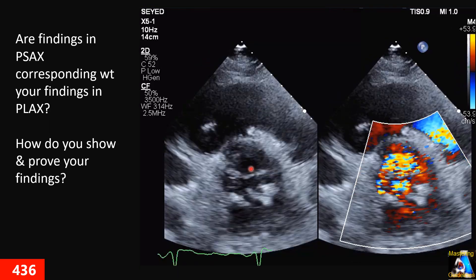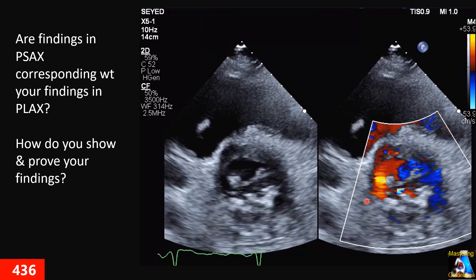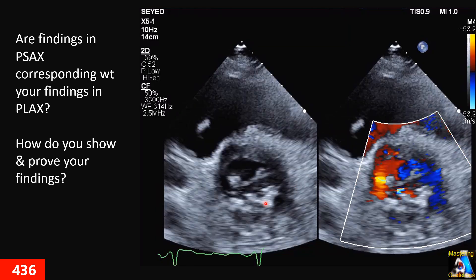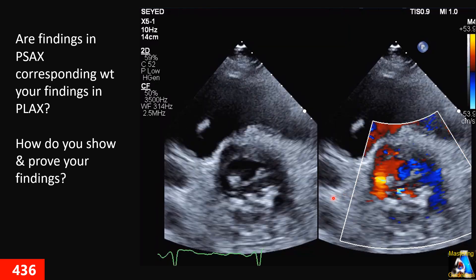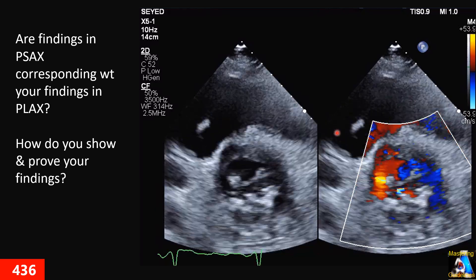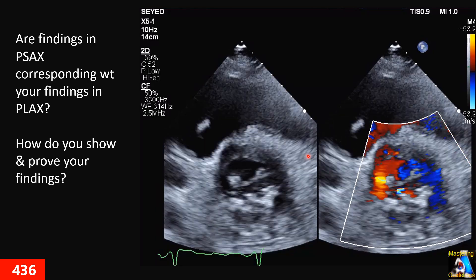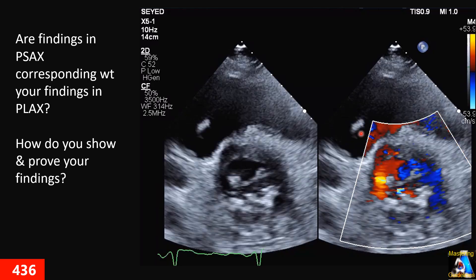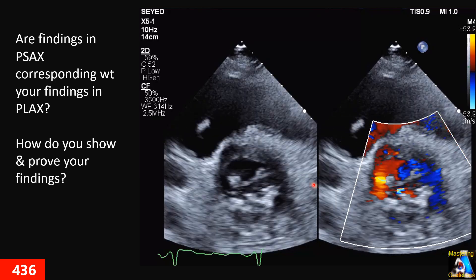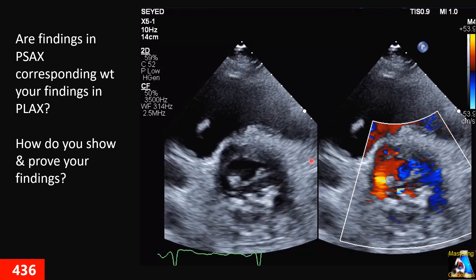You go to the parasternal short axis at mitral valve level and you get this comparison clip between the 2D and color. On this clip, do those findings correspond and are similar to the findings on the initial images or not? And how do you show and prove those findings in this view?